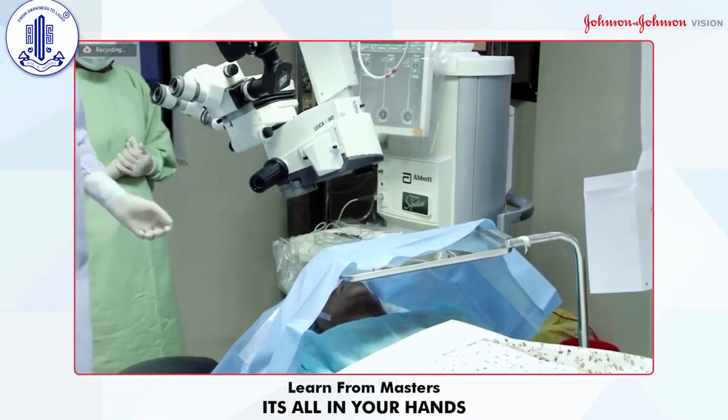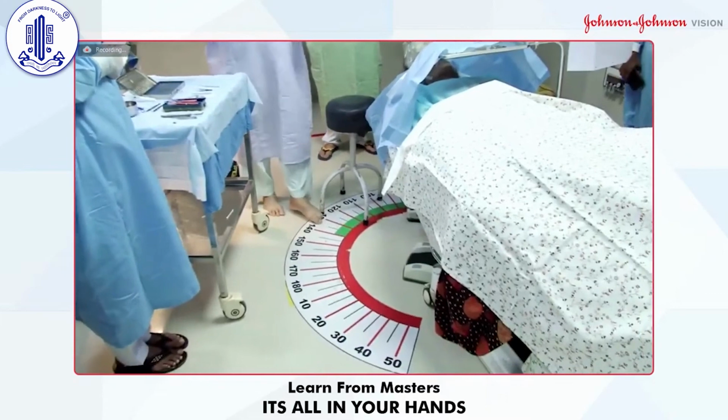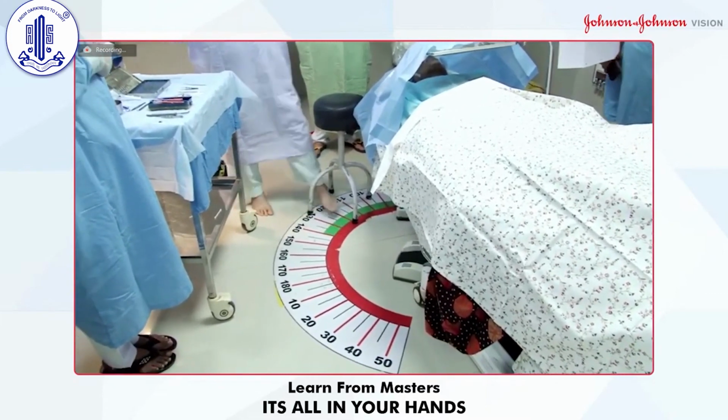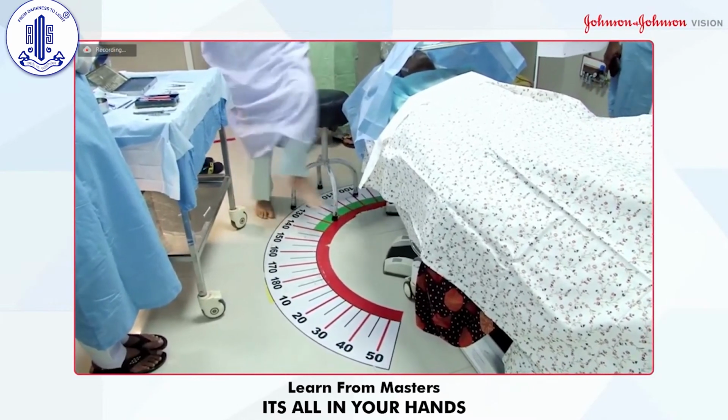And now here you can see, focus here. It is 135 degree. So my right hand will be here. So I'm going to put the incision exactly at 135, more or less.